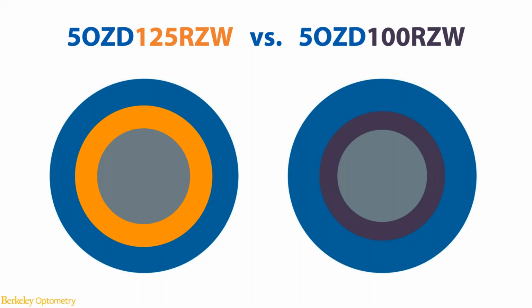While we're waiting for more solid evidence from more rigorously designed, hopefully randomized clinical trials, a thorough understanding of how the design differences transfer to corneal changes, and again, one step further, its impact on retinal defocus profile is extremely helpful in guiding lens design modifications.